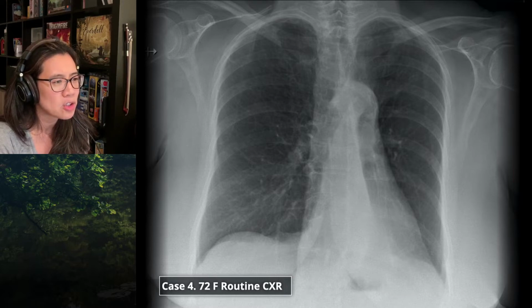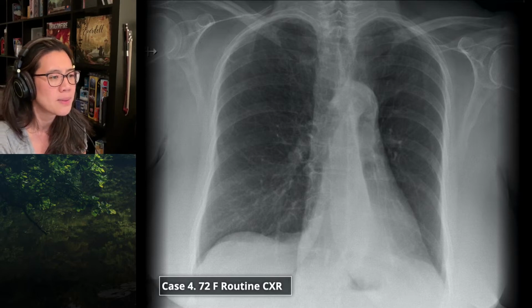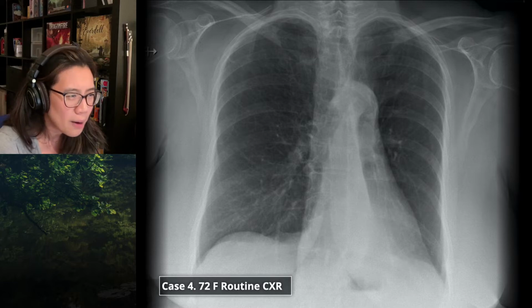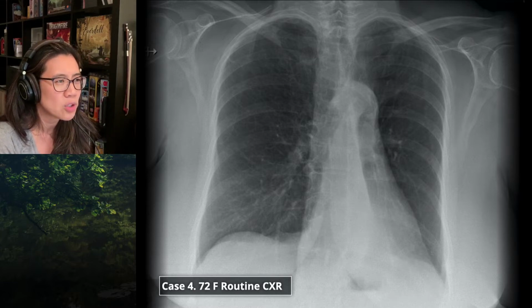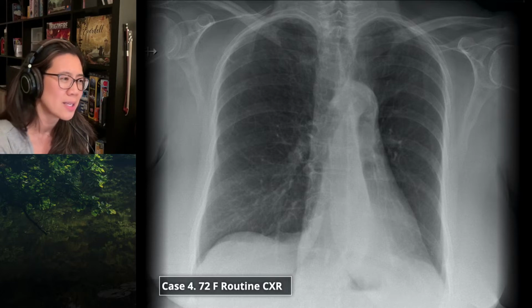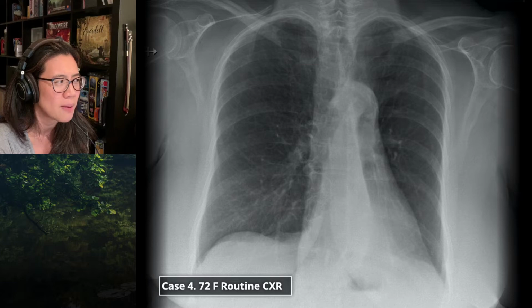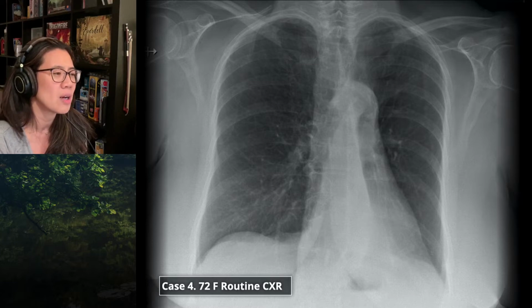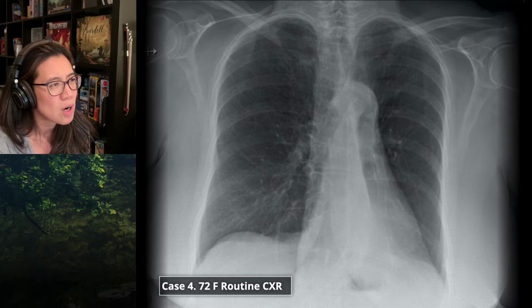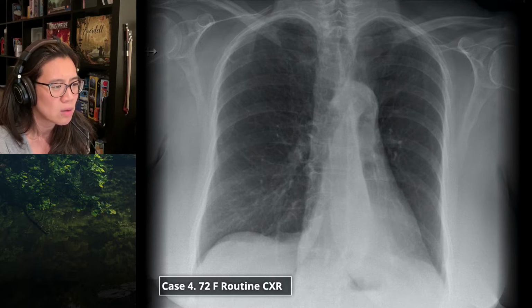In an adult female patient, the causes of a left lower lobe collapse, if this is a new finding, then I'd be concerned about a central obstructive lesion such as a bronchogenic carcinoma. Is there a history of aspiration or some sort of foreign body that's caused the obstruction? Other causes, if it's a routine X-ray and she hasn't had any recent surgery, then I don't think it's a collapse due to splinting or a post-surgical status, and that hasn't been given in the history. So my diagnosis of exclusion here is a central obstruction with left lower lobe collapse as a result.